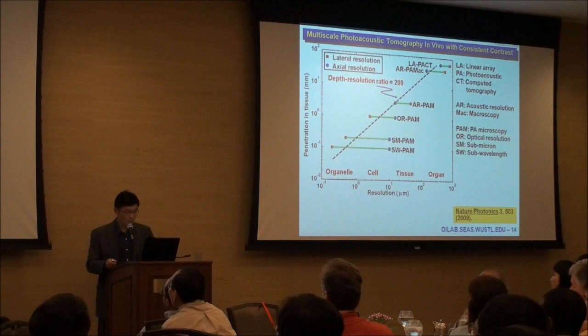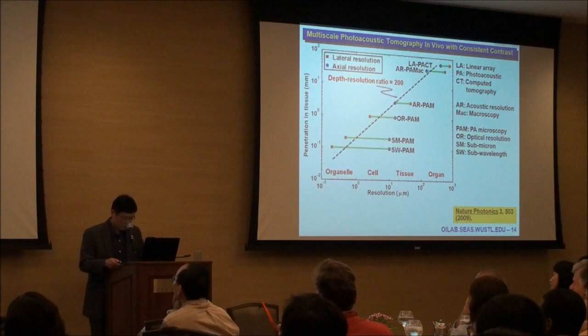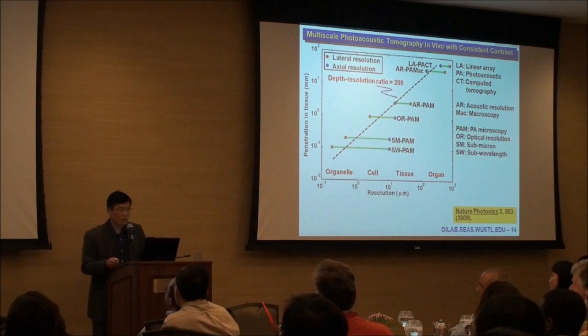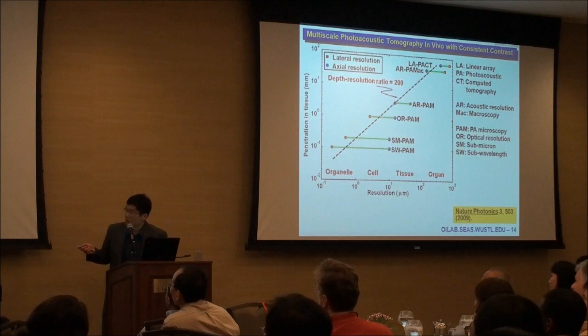You wonder why photoacoustic tomography is so exciting. Why do so many people want to join this field? Well, my explanation is all shown in this chart. While all imaging modalities are complementary, photoacoustic tomography is very unique. It is the only modality that provides multi-scale imaging, ranging from organelles, cells, and tissues all the way to organs, and does so with the same contrast mechanism, optical absorption.